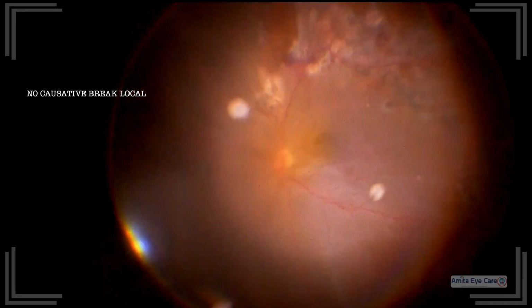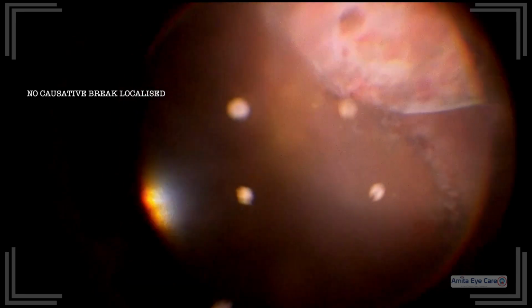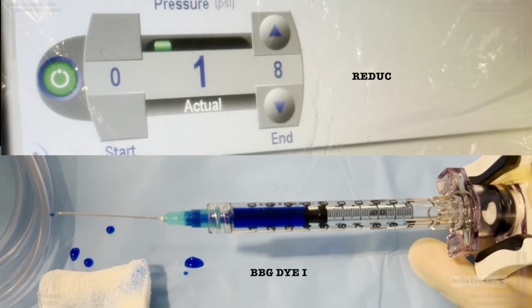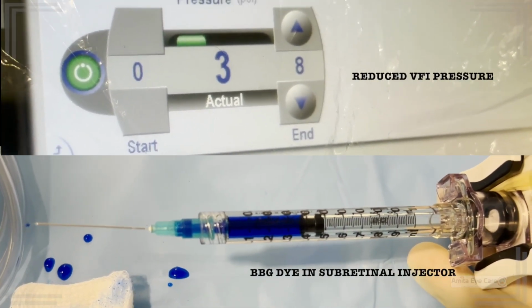Intraoperatively, a retinal break could not be localized and hence subretinal injection of BBG dye was thought of. BBG dye was loaded in the subretinal injector and the injection pressure was lowered. A 41-gauge needle was used to inject the dye in the subretinal space.